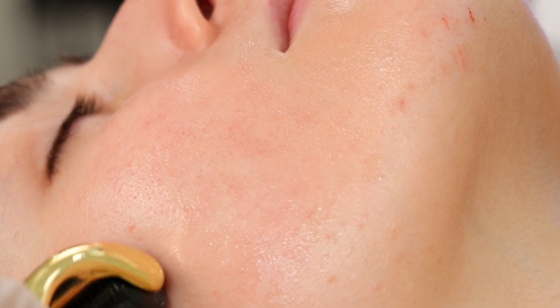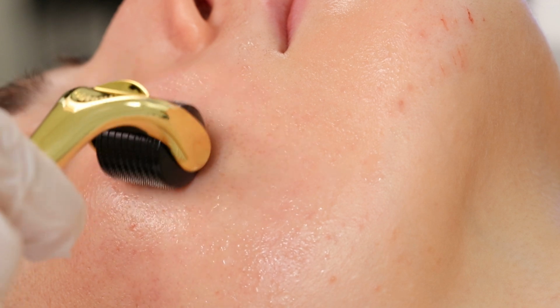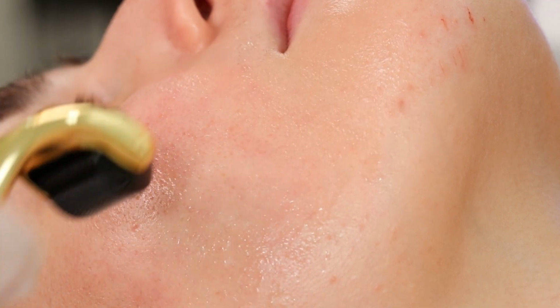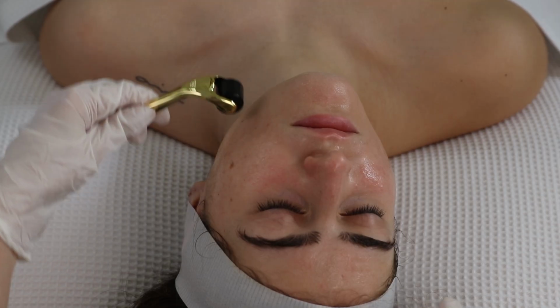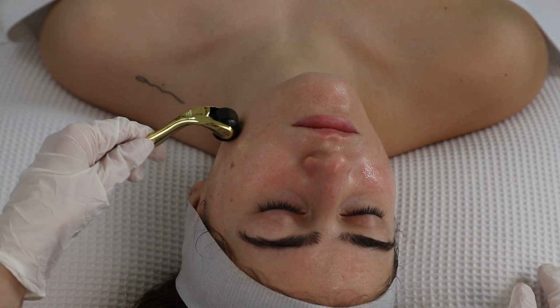The reason why we change the direction is to actually allow to open up a lot more microchannels into the skin, which then optimizes the penetration from the chemical peel. Once the right side of the face is done, you can move on to the left side, and for this you're repeating the exact same process.